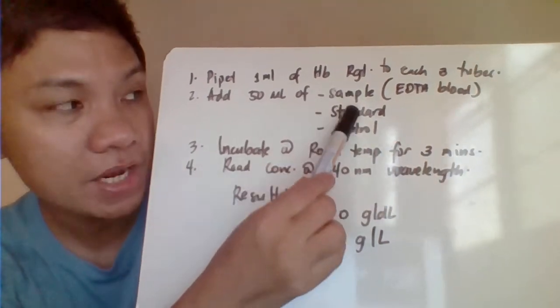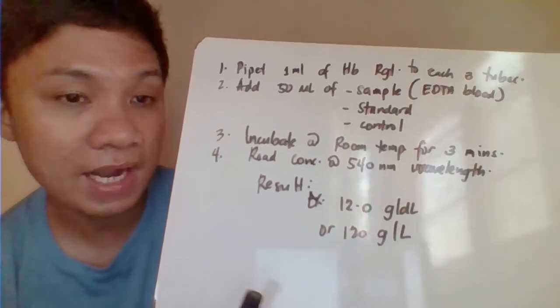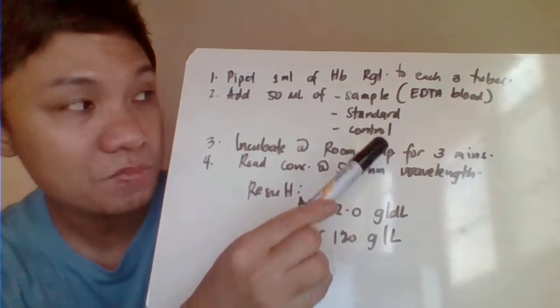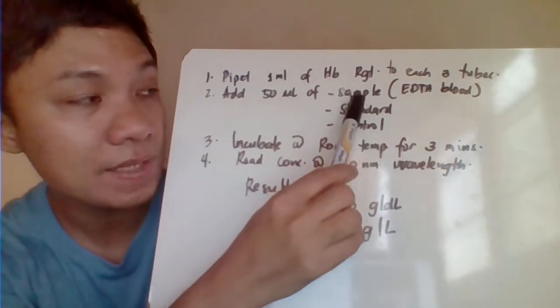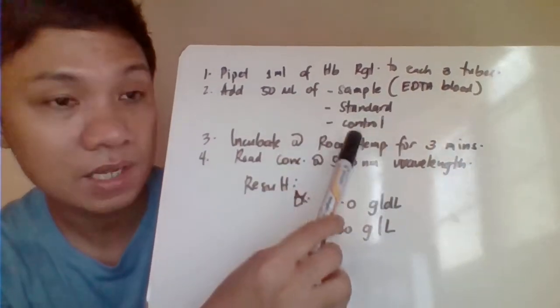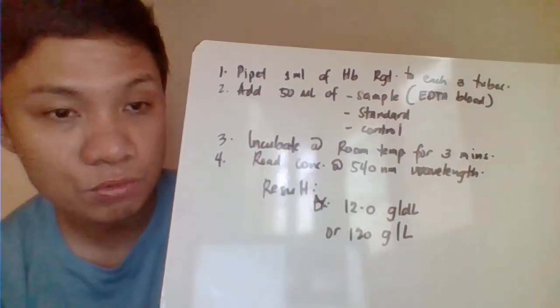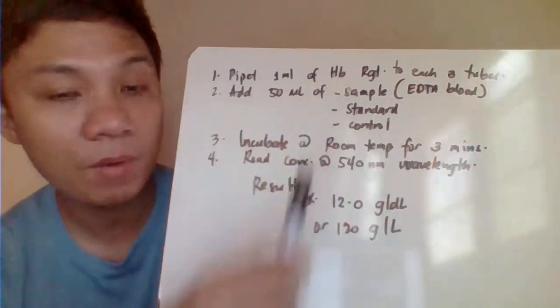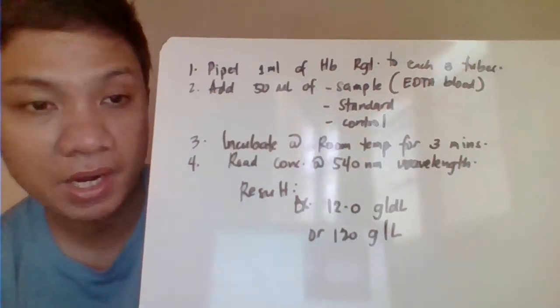To each of these tubes, you add 1 ml of our hemoglobin reagent. Then aspirate 50 microliter to each of your test tubes: 50 microliter of your patient's EDTA collected blood for the sample tube, then 50 microliter of your standard for the tube labeled standard, and another 50 microliter of your control solution for the control tube. Each has 1 ml of hemoglobin reagent. You incubate that at room temp for 3 minutes.